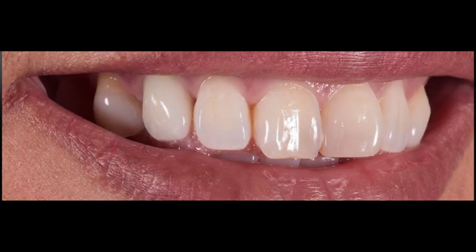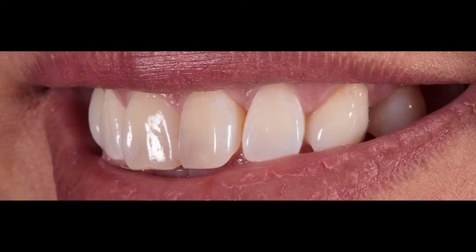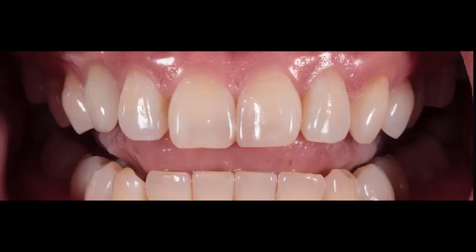And then we were able to recall this patient back at 18 months, and at 18 months, once we recalled the patient, we could observe that the restoration was still blending in extremely nicely with her smile. She was extremely happy now that she didn't have that congenitally retained deciduous tooth ruining her smile. Here's the close-up of this Emax restoration. Again, it blends in really beautifully with her natural teeth, and even if you compare it to the contralateral canine, it really blends in very nicely here in her smile and in her dentition.